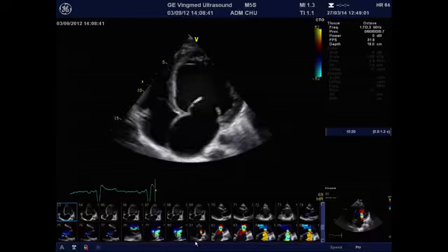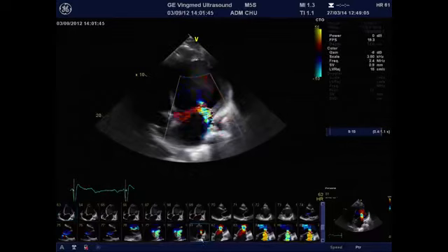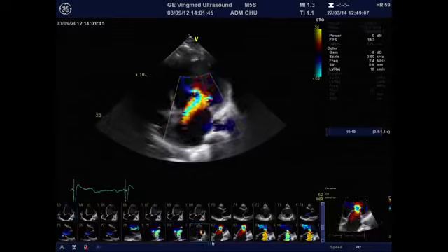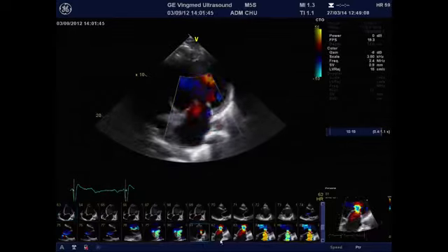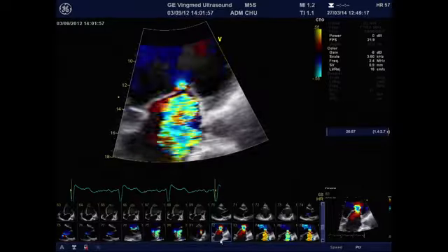So with the apical view, we need again the color. And here you have the regurgitation. With the regurgitation that you can get, for sure, you need to zoom. And why you need to do this? Just to maximize the frame rate, of course. So in these patients, always use a small box, as narrow as possible. And also the imaging depth should be reduced as narrow as possible.